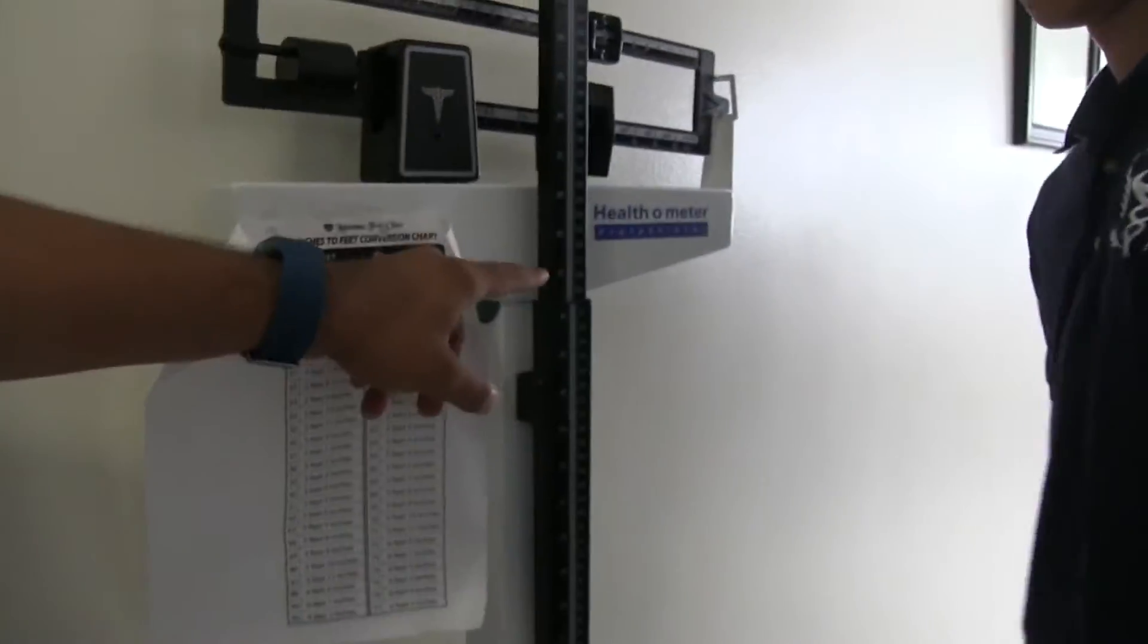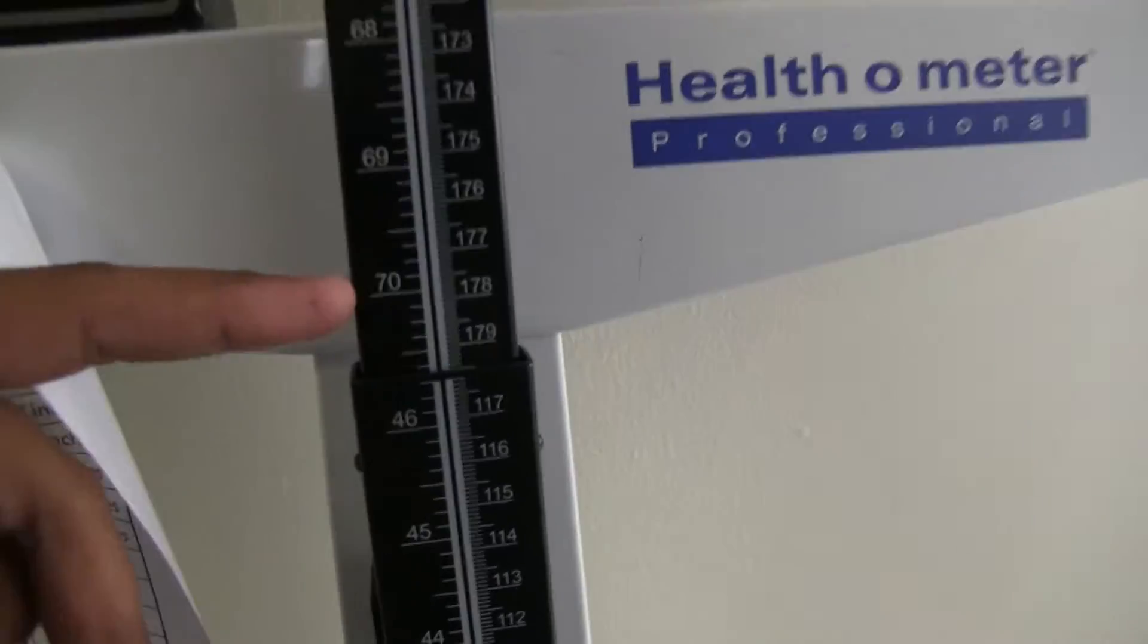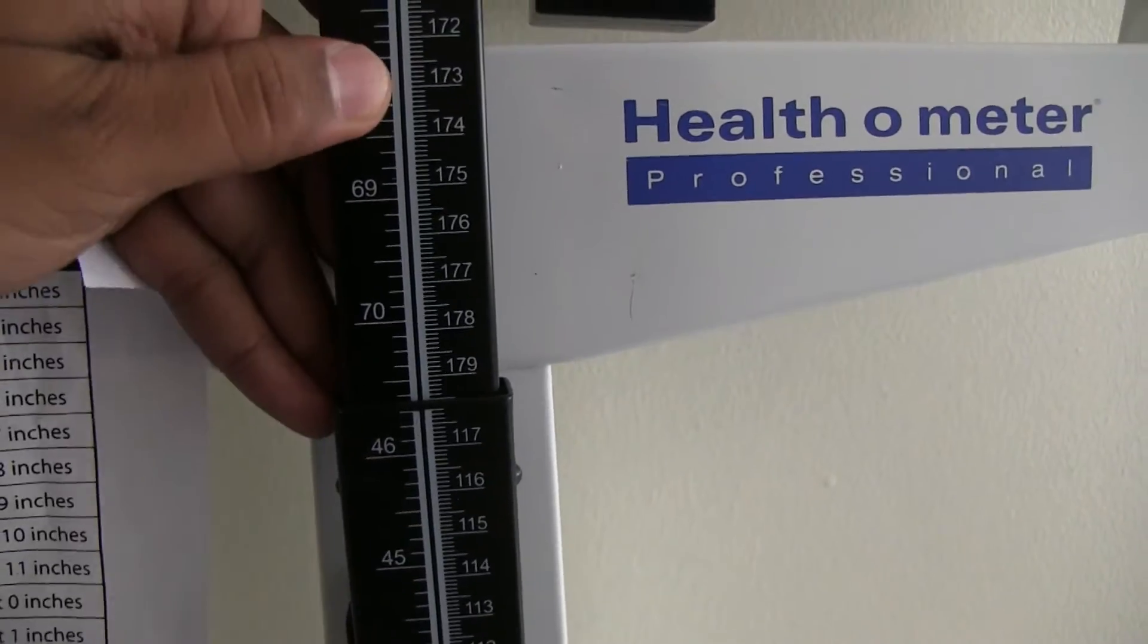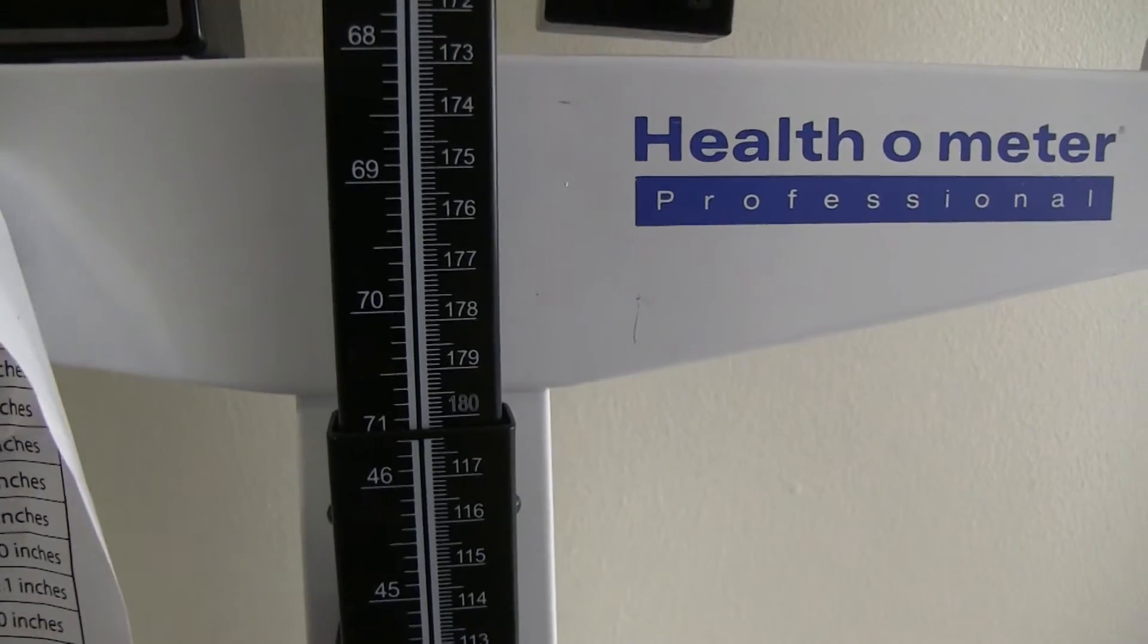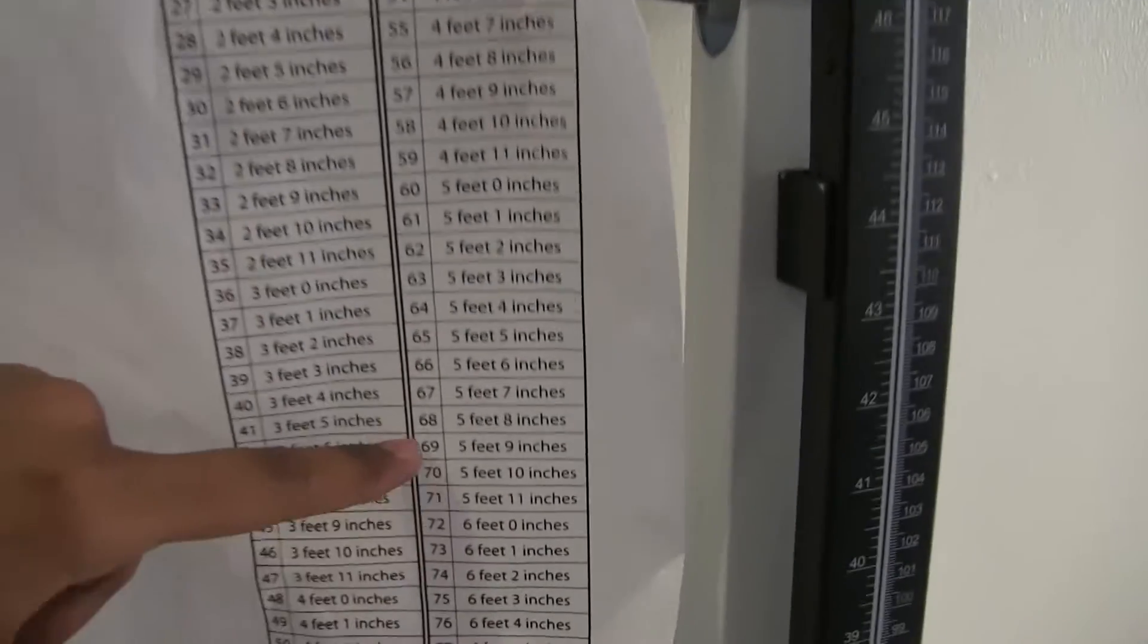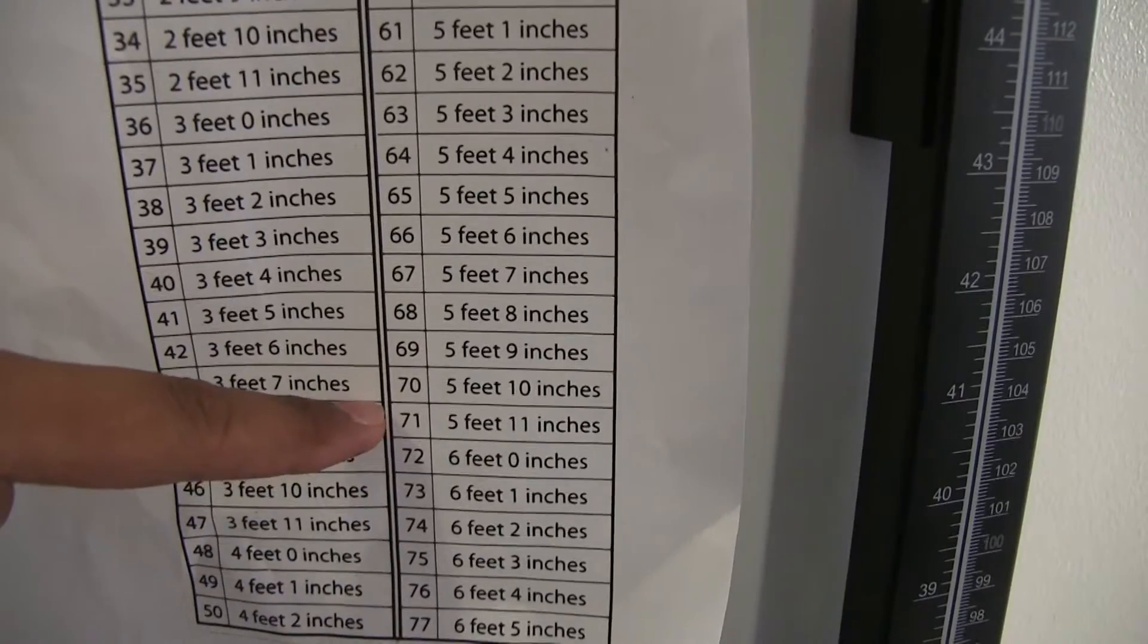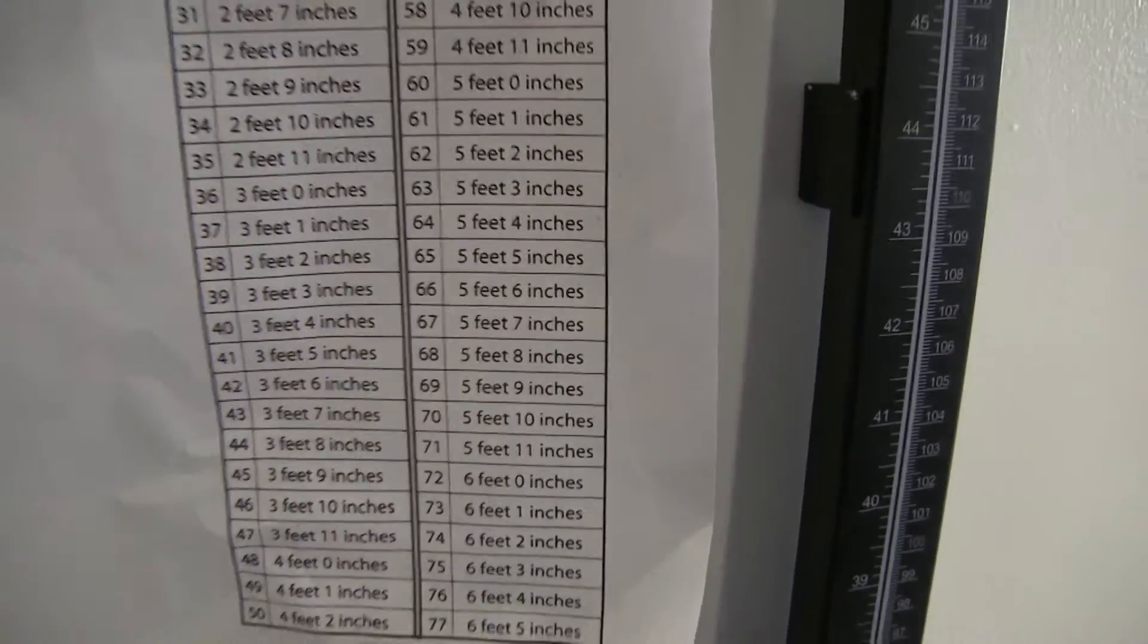At the bottom you will get a number, so right now it looks like it's between 70 and 71 and you have this chart right here, you can see 70, 71, it's about, you can say 5 feet 10 inches for the patient.